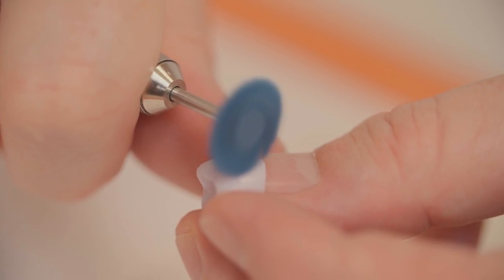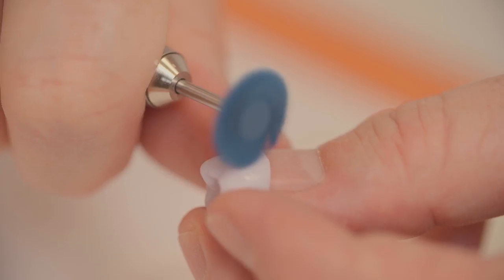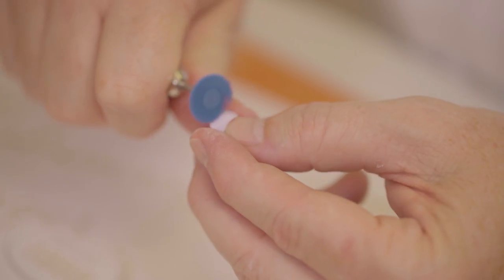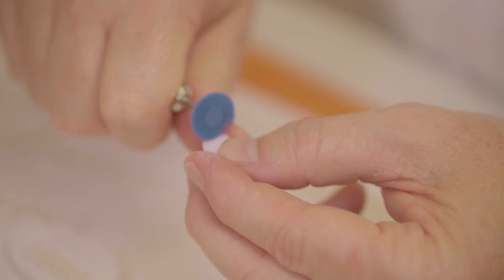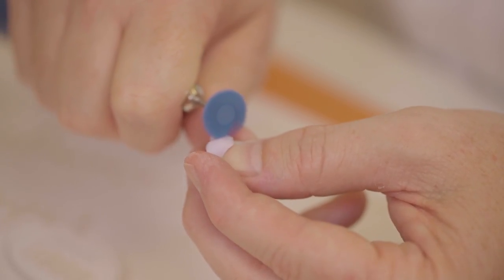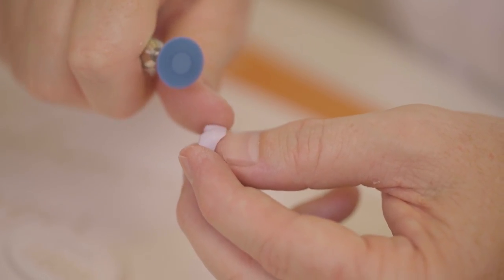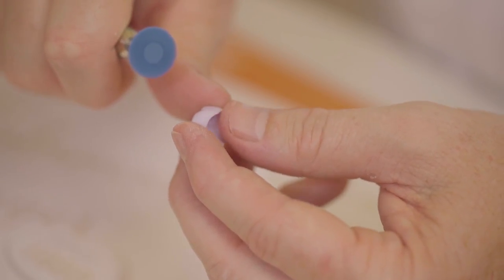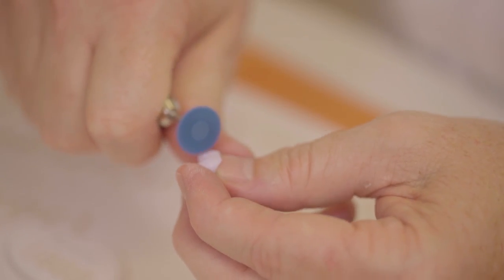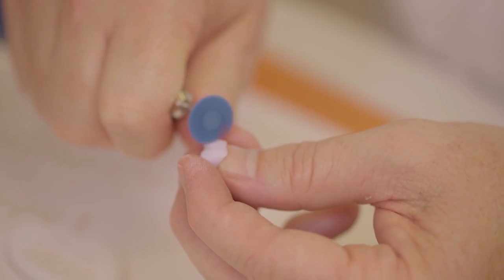So again, we're going to work through this. We're going to let this wheel do all the heavy lifting for us, and it's given us a really nice finish onto the restoration already. I'm not going to be bouncing all over it. I'm taking it down to the margin. You're not going to hurt your margin with this. You want to be careful not to run the twist polishing wheels this way because it will actually rip the wheel up. You want to protect your margin and run this down towards your thumb.